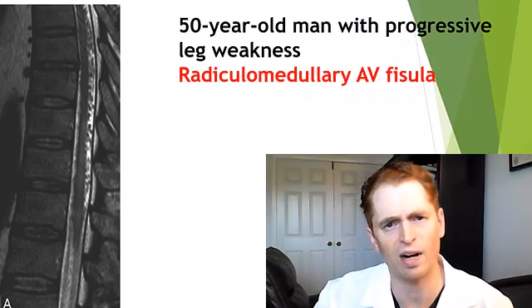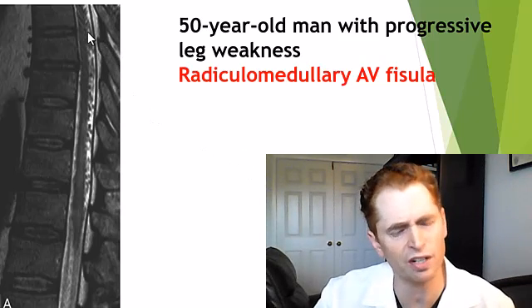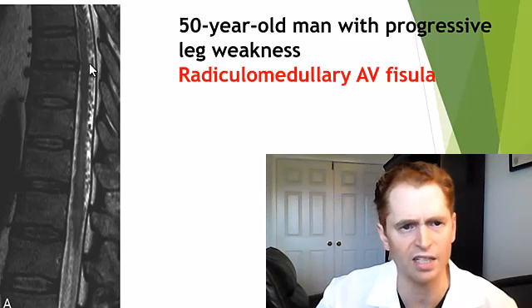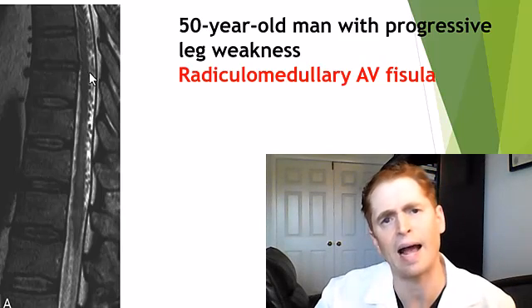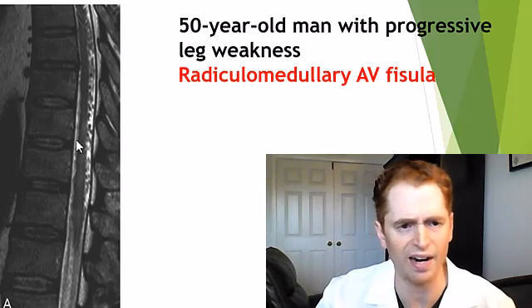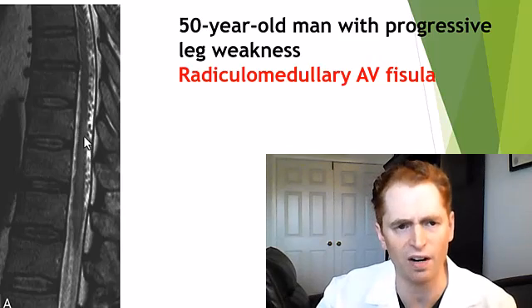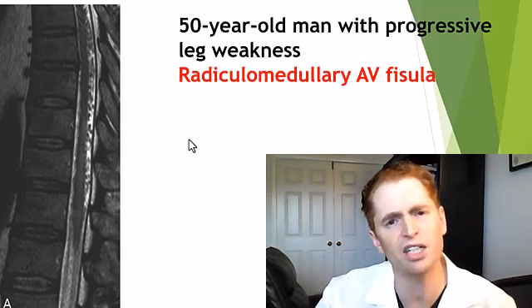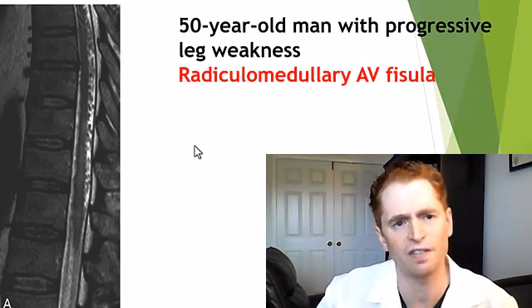This is the spine MRI of a 50-year-old man with progressive leg weakness. Posterior to the spine, you see small dark dots consistent with blood vessels — this is a radiculomedullary arteriovenous fistula, an abnormal connection between the veins and arteries that can lead to stroke of the spine. There may also be bright signal representing edema or infarct of the spinal cord. This lesion can be treated with catheter embolization to resolve the fistula, though it's quite risky.